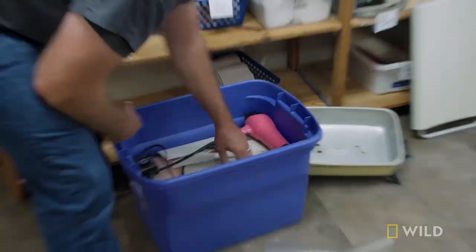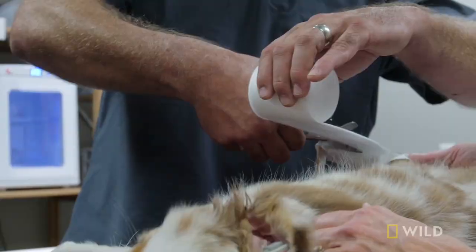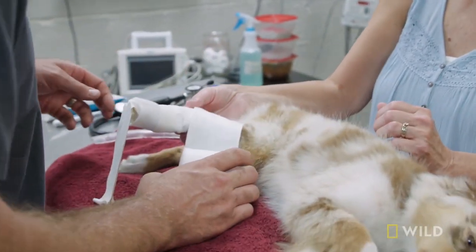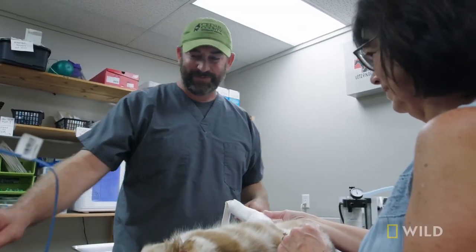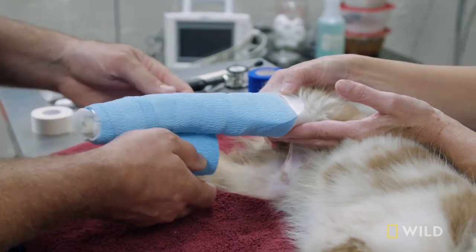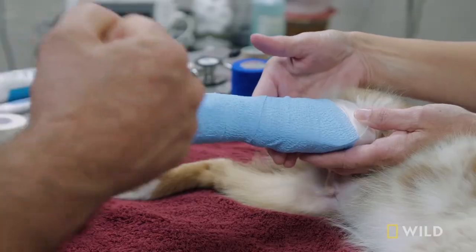The next thing we're going to do is that splint. Is that going to be just the right size? I got an award for the best bandager my senior year of vet school — and Erin didn't. I remind her every time we put a splint on. On puppies, they can outgrow a cast, so we sometimes just do splints and splint changes. There we go, Lori. I still got it. Yeah, that looks good.